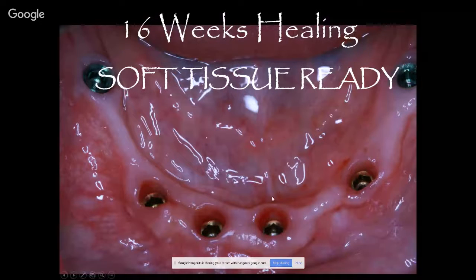This is the soft tissue healing around my implants. And this was the part of the presentation in Washington, D.C. at the AID meeting that I won a prize on for soft tissue adaptation around implants non-surgically. And basically the point was allowing, based off principles of biology and soft tissue, for secondary granulation and thickening of the biotype and the soft tissue in these areas without using palatal tissue or without using alloderm.